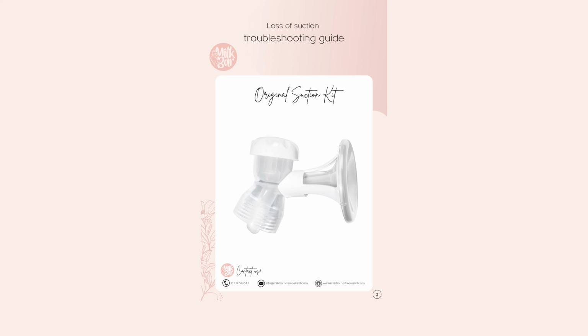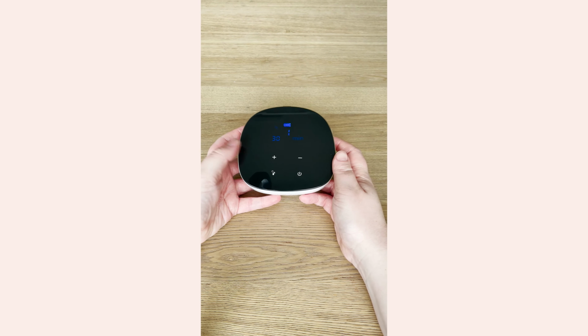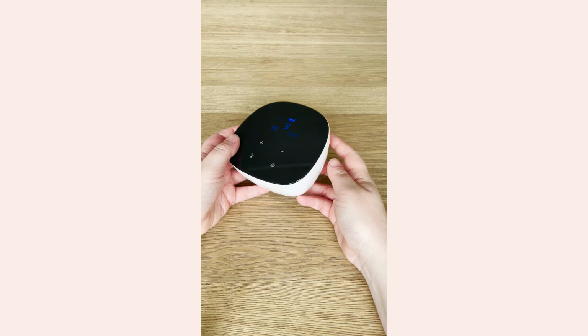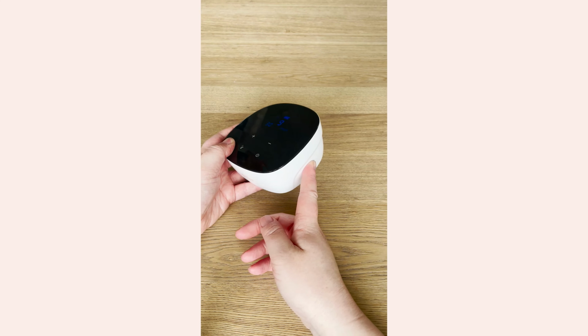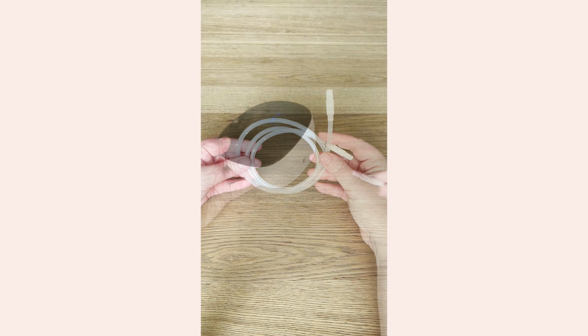There are a few things that can cause loss of suction, and we're going to work through the most common ones now. First of all, with your pump going on the highest suction level, remove the tubing and place your finger over the holes. If you can feel the suction, the issue is most likely to do with the setup of your kit. Check over the tubing, making sure there are no kinks or damage of any kind.